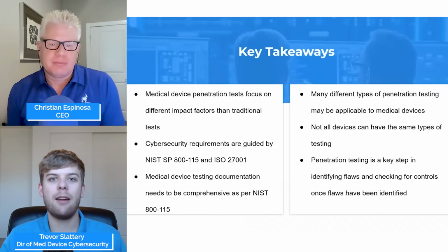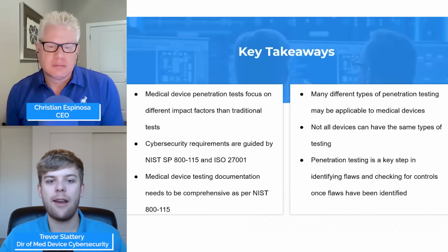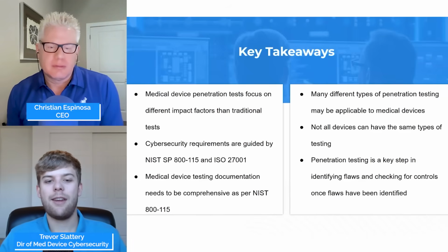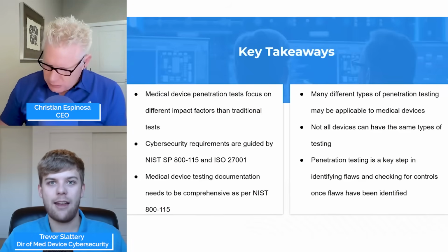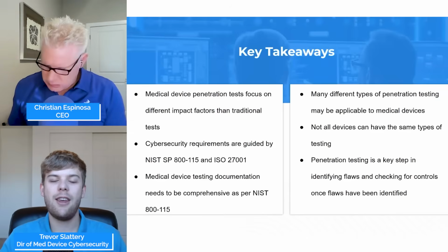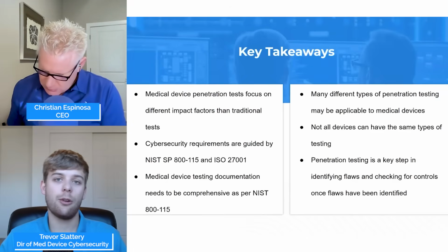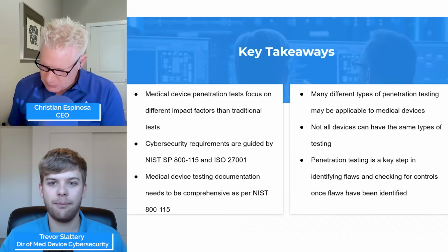Cybersecurity requirements are guided by NIST Special Publication 800-115 and ISO 27001. Medical device testing documentation needs to be very comprehensive as per NIST 800-115. That's when we're looking at the test plan, the test cases, and the report, and making sure we're hitting the right level of detail in all those and the expected information.